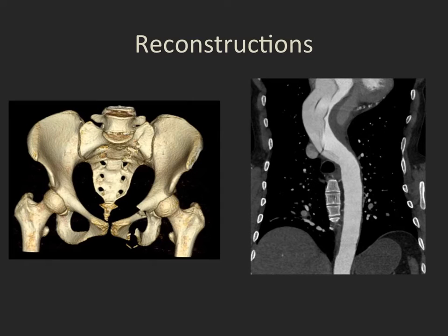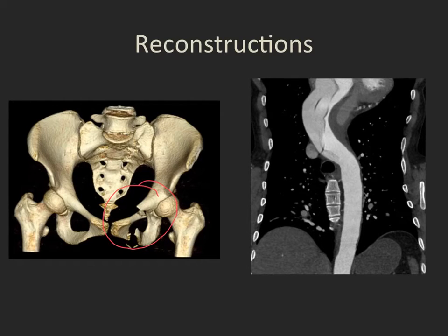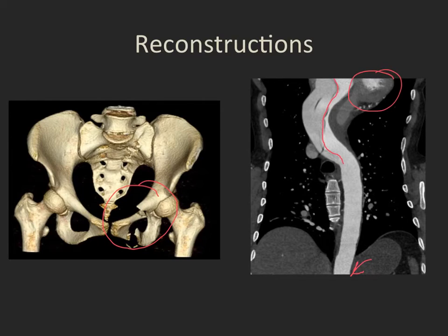On the left is a 3D reconstruction of the pelvis in a patient with multiple complex pelvic fractures, which can be rotated and manipulated for the orthopedic surgeon to plan surgery. On the right is a multi-planar reconstruction of the thoracic aorta in a patient with an aortic dissection, where the technologist has laid out the aorta from the heart down through the diaphragm, allowing us to see the plane of dissection from the ascending into the descending aorta in a single image.